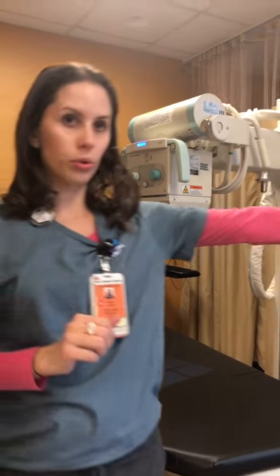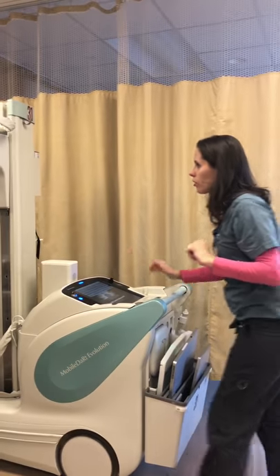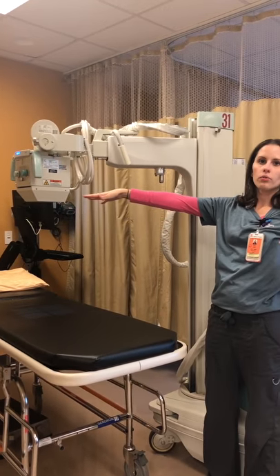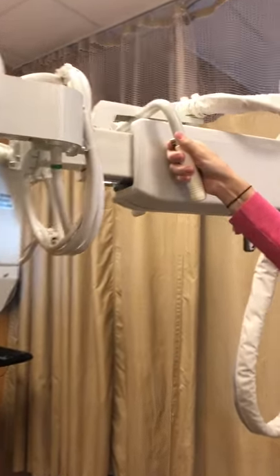If I'm in a position where I'm actually across the room and I still need to be able to get to my tube, I'll reorient it. So if I'm all the way extended out and I can't get to that side of the room but I still need to move it forward, there is a button here.